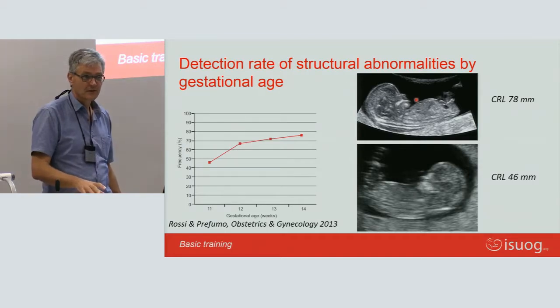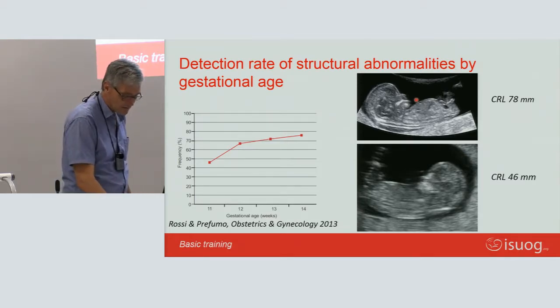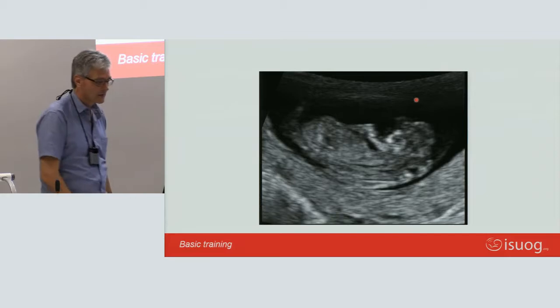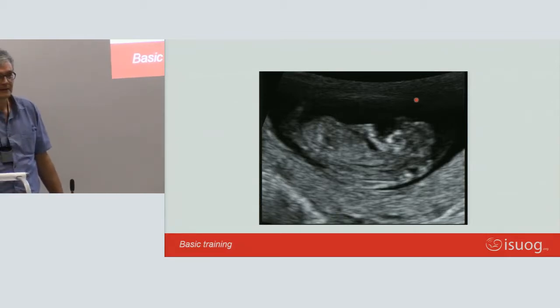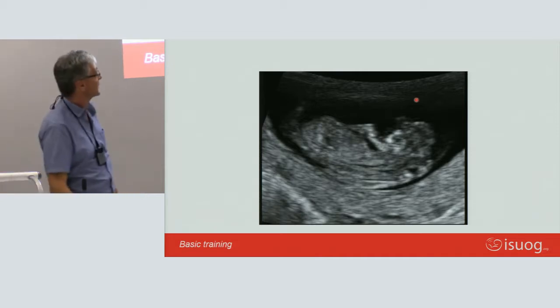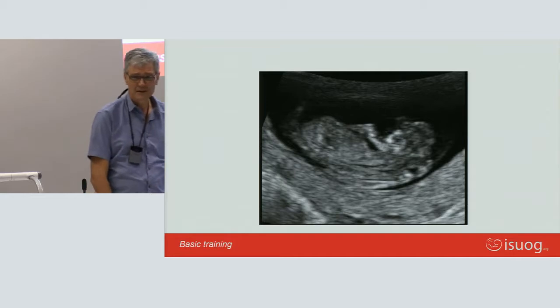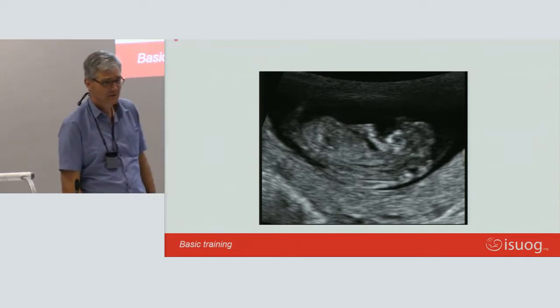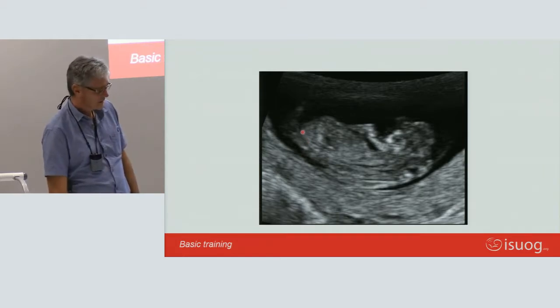Questions so far? Right, so let's go and look at a couple of abnormalities. What's wrong with this poor baby? Is there anything wrong with this baby? Yeah, you can't really figure out what's head and what's tail, hey? So it's, well, believe me, that's a baby's tail end.